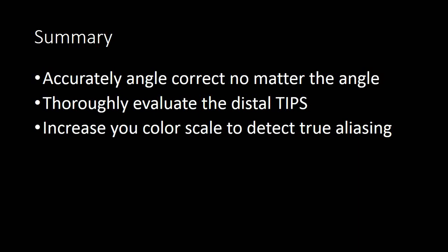I will be developing a cheat sheet or handout that will go with it that can be used as a quick reference for performing TIPS ultrasound.